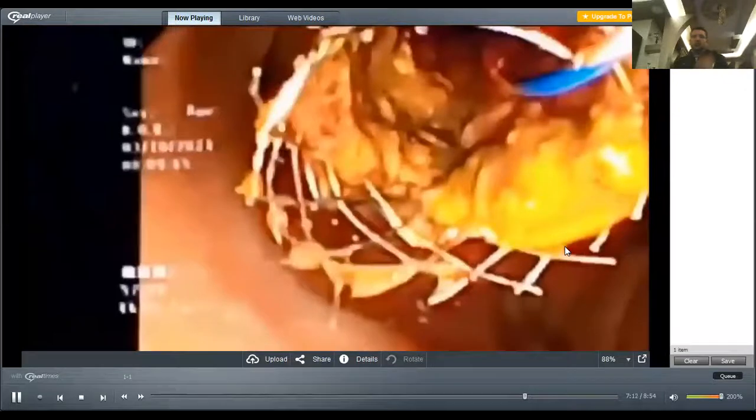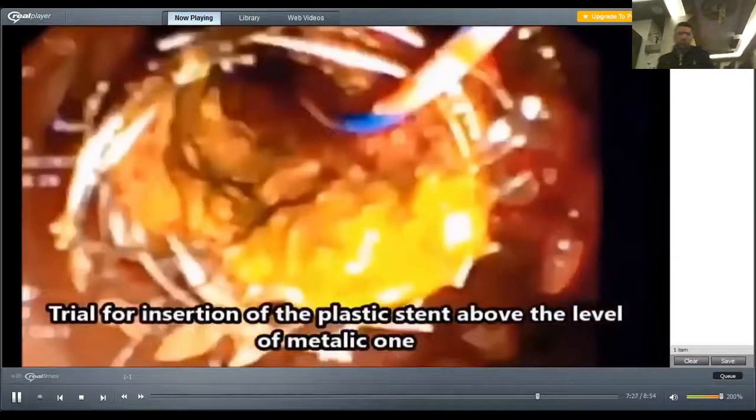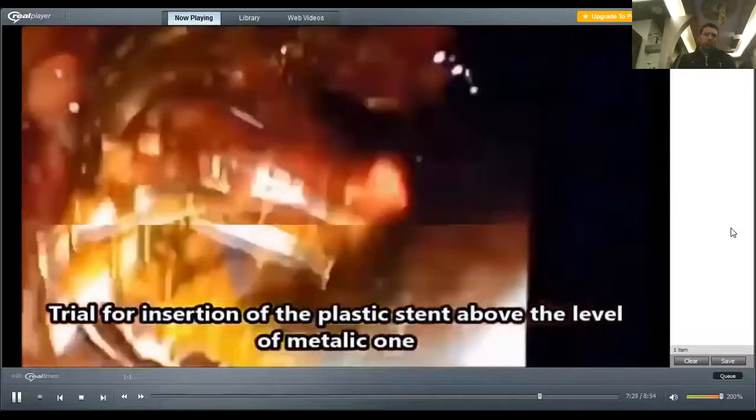The stent now started to appear again to pass through the guide wire into the obstructed metallic stent. We are trying to approach above the level of the obstruction. We will try.